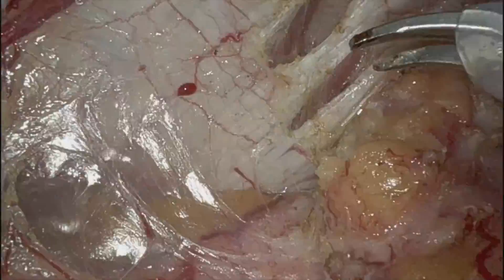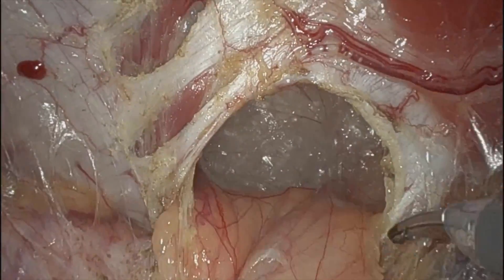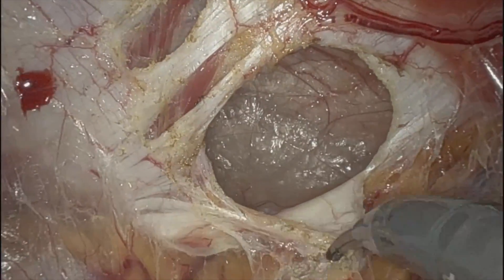The nerve distribution in the semilunaris, as you know, can be variant. So I try to stay directly on the hernia sac. I don't drift anywhere — medial or lateral.